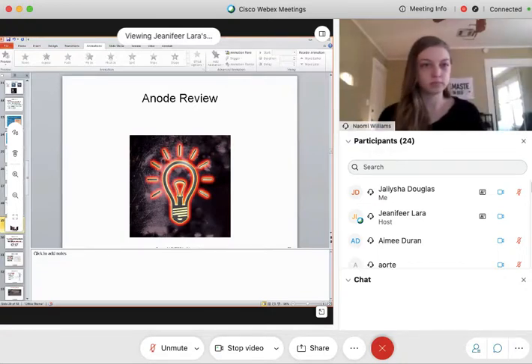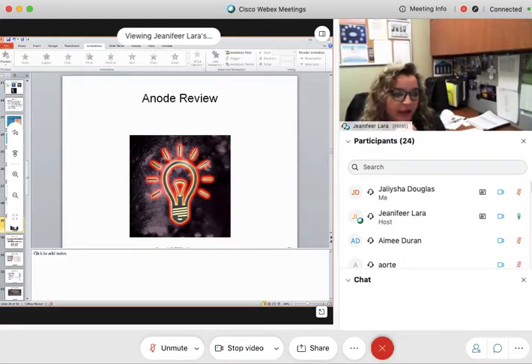That's tungsten? You know what, let's do this. T, tungsten, is for target. Only target. T, tungsten, target. Not for the entire construction. Got it? Thank you, Naomi.